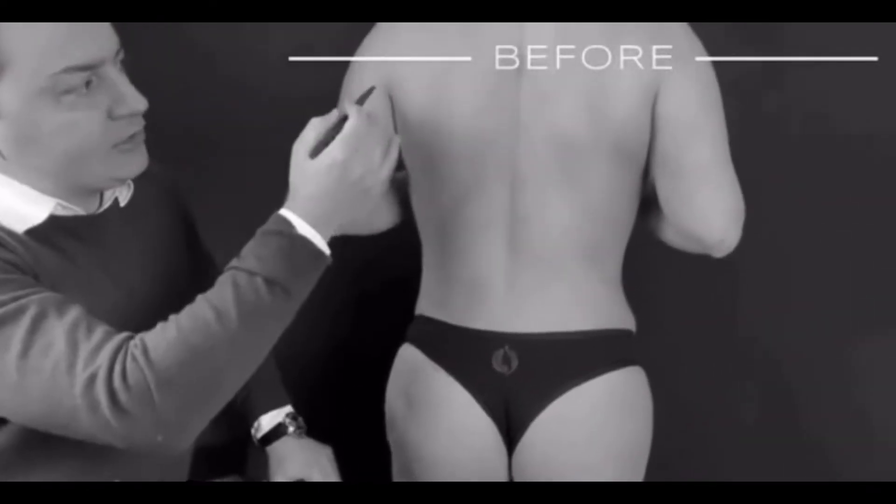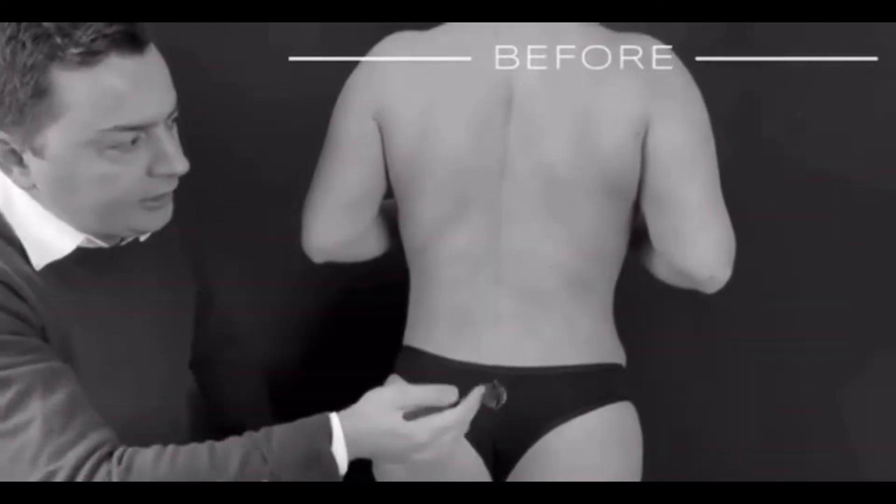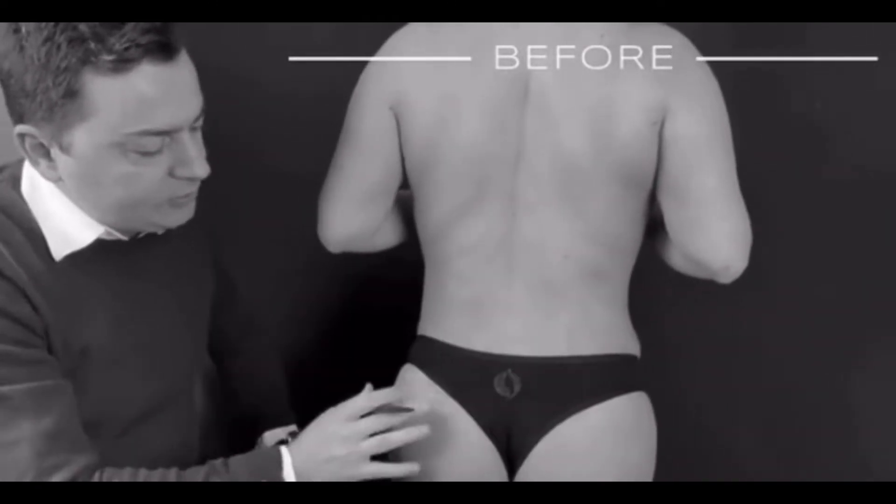So there will be three incisions — one, two, three. And I will take out all this fat tissue through the same holes.